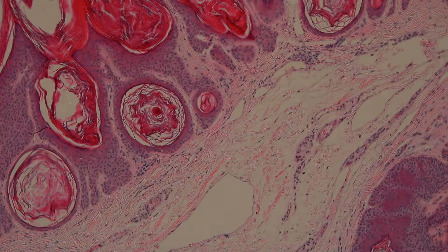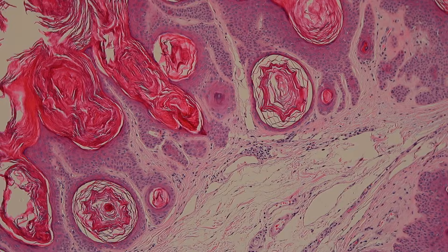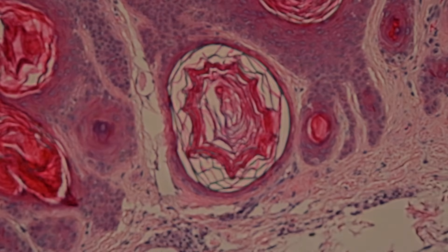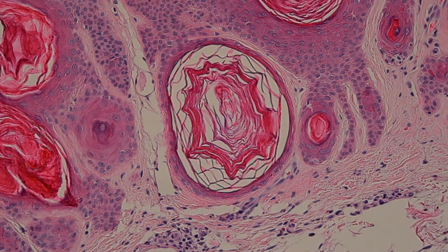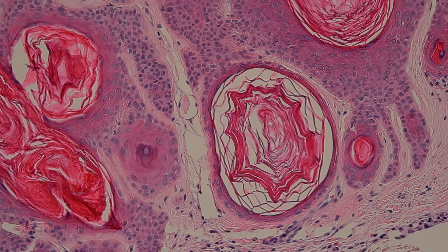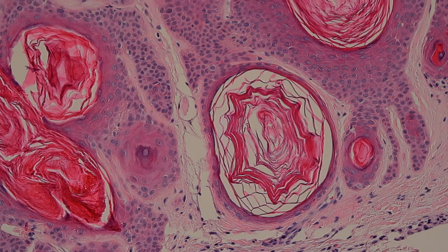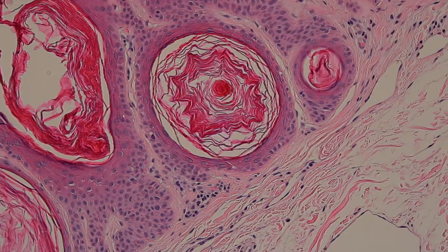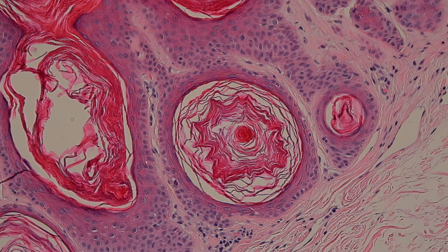Sometimes they do this really cool thing where they look like a little star or like a spider web — they're quite beautiful. Seborrheic keratosis most people consider to be pretty unsightly when it's growing on their skin, but under the microscope they're actually very pretty lesions because the keratin is so brilliant in its color. Those little spider web-looking ones are a perfect decoration for Halloween or something. There's your horn pseudocyst again.